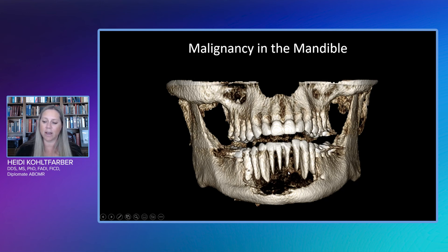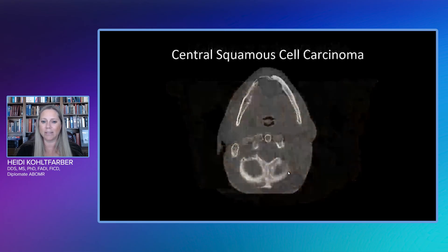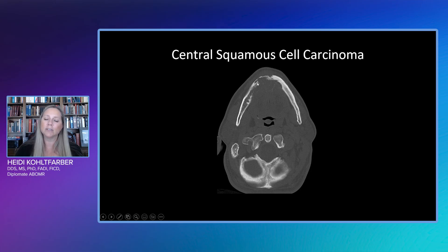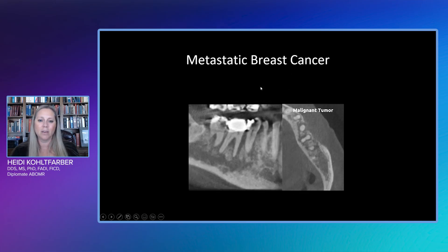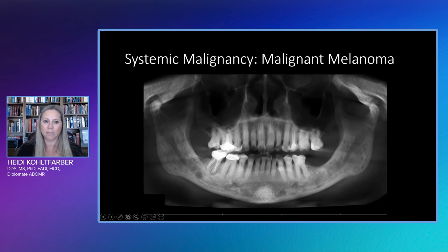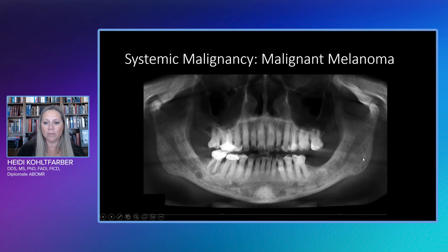Something to think about if you see slightly atypical periodontal bone loss or atypical hypodensity — this case showed a moth-eaten appearance within the mandible, which lets us know we have a malignancy. This was a central squamous cell carcinoma — a very unusual and interesting case. Metastatic breast cancer is another reason we look at cortical borders as we go through CBCTs. Here we have loss of cortical borders and a moth-eaten hypodense appearance. We can also see systemic malignancies, such as malignant melanoma, which presents as multiple punched-out lesions throughout the mandible.